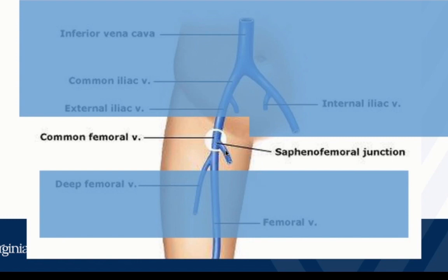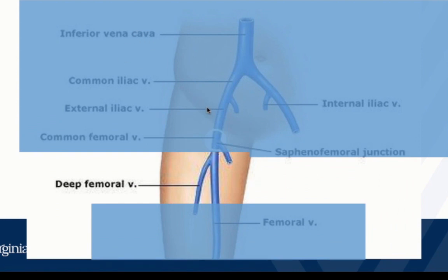The saphenous junction is usually going to be medial and superficial. Once we find that, we start to track distally following the common femoral vein, and we want to make sure we catch the deep femoral junction where the deep femoral vein splits off — it's going to be very vertical and comes and goes very quickly, so we have to be meticulous to find this. Then we follow this vein down as far as we can, especially anywhere they have pain. Don't just stop at these junctions — find the veins, find the junctions, make sure all the veins compress, and follow the vein all the way down.